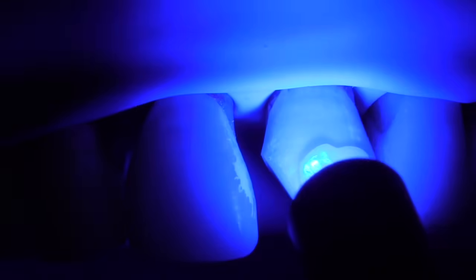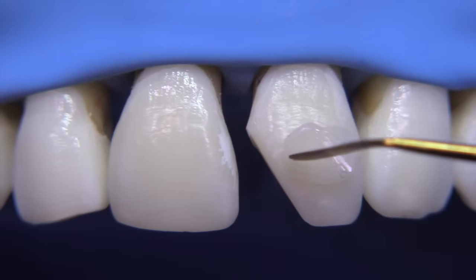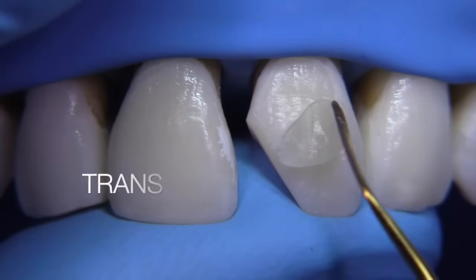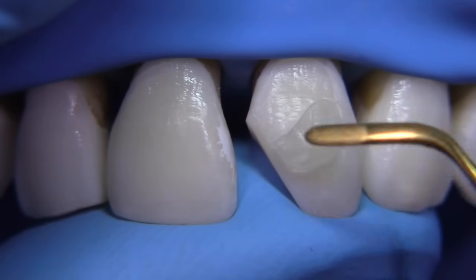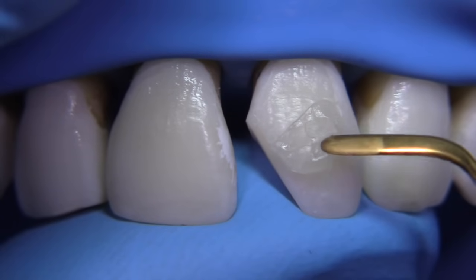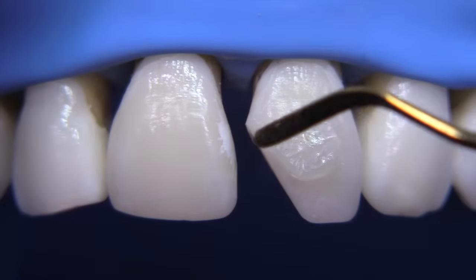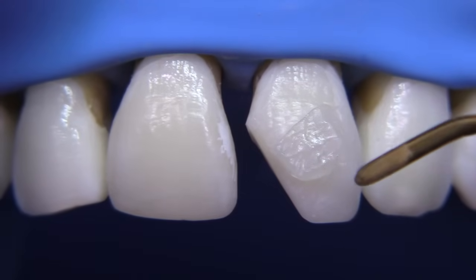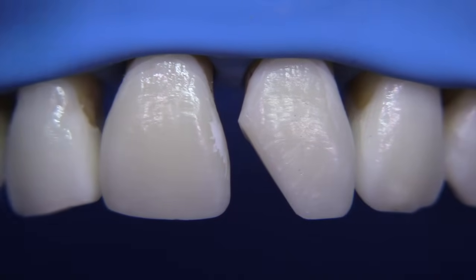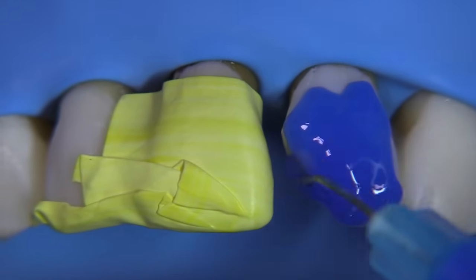You can see that shade change before and after curing — it's really obvious. I'm also going to try a translucent on here to see how that looks. Translucents seem like they would be wonderful, but a lot of times they're going to create a lot of graying of the composite — you have to be really careful. We are going to use a translucent on the lingual because you need translucent interproximal, and if you used opaque there you would have no flexibility.